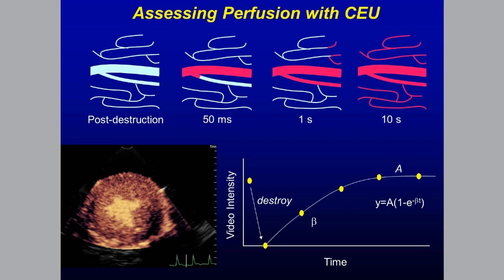I also don't think that you should just limit this to saline. I think that we can also do that with left heart contrast. But one of the things that I think people tend to forget is that you should still use all those wonderful tools that we use when we're using 2D imaging. You should bring down your mechanical index in the Doppler. You should also bring down some of those gains and other settings, or other tools that we can use, to get that nice balance in the signal. Yep. Yeah, and I want to reiterate what Monet just said, which is, you're going to have a complete blowout of your signal if you use a big contrast.